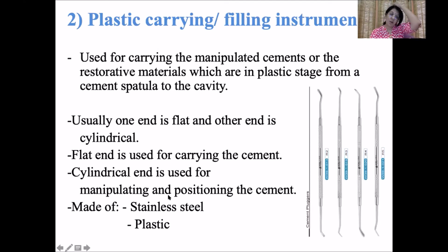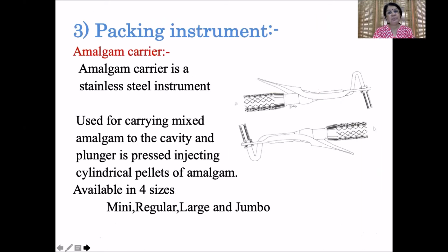You have all seen the plastic carrying instrument. Recollect that, and you will remember that there are two ends there. They are generally made up of stainless steel or plastics. The plastic ones are the disposable single-use ones.